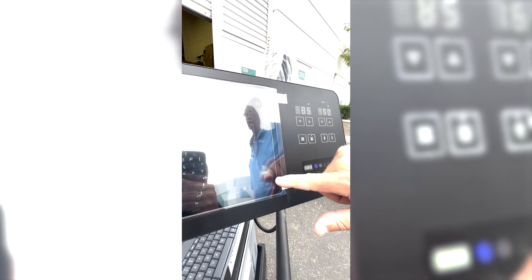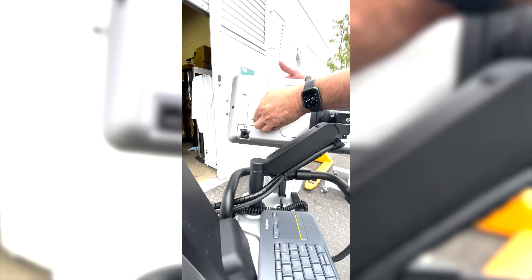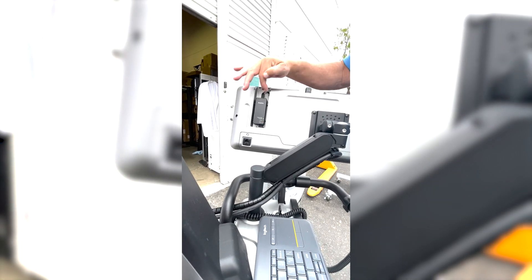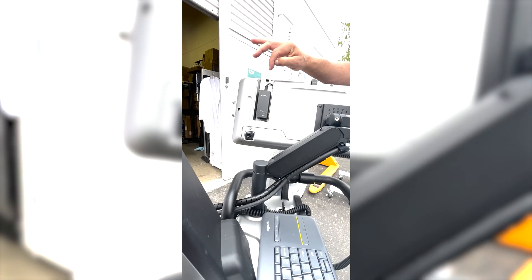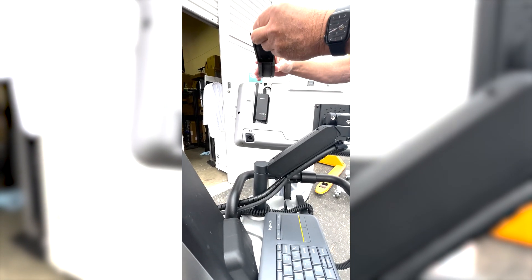Down here it shows that the DR panel is connected and is 90% charged. It shows that the PC is up and running and communicating. This little icon shows you when it's delivering an image, and finally the Wi-Fi connection shows it is communicating out to the network. Also on the back of this — which we do not touch — is what we call the internet access, which is used for the Wi-Fi panel connecting and communicating directly to the DR panel. So that is the Wi-Fi source and you never touch this.